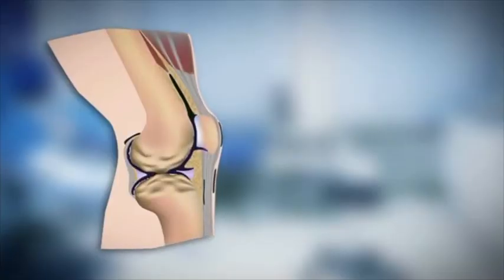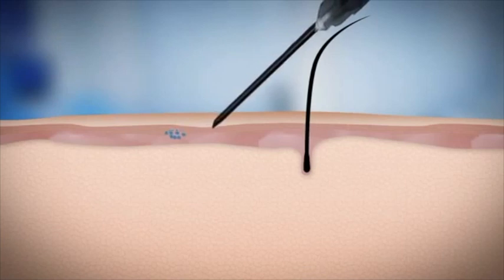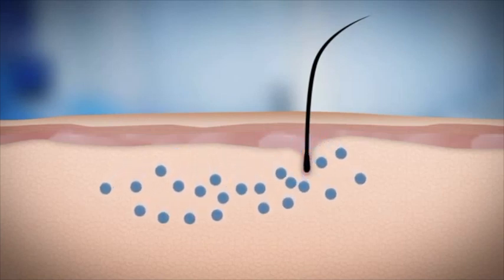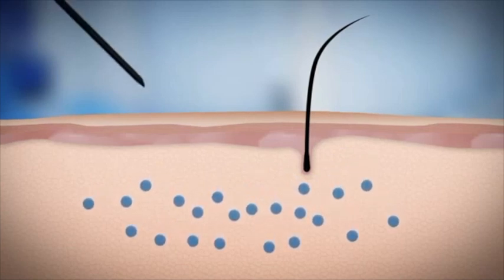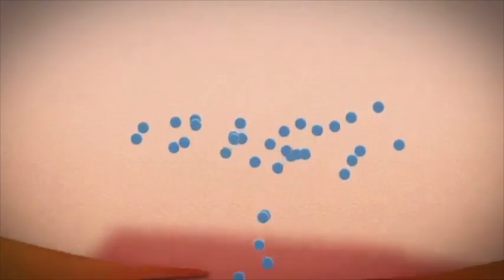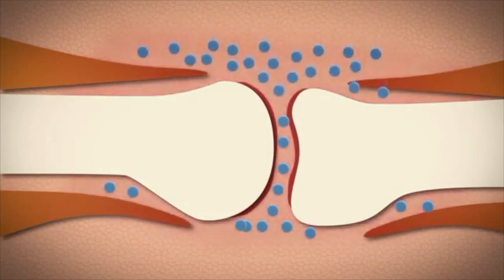For example, in the case of painful osteoarthritis due to an inflammation of one or several joints. At the beginning of the session, the needle performs linear micro-scratches to open the skin barrier and allow the product to penetrate. The liquid spreads via diffusion, guaranteeing a long-lasting effect. The solution is then injected directly into the middle and deep skin layers. Thanks to this technique, the active ingredients immediately reach the damaged area and help to fight inflammation. Step by step, pain and discomfort will diminish.